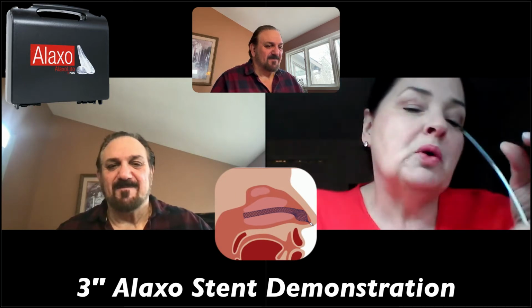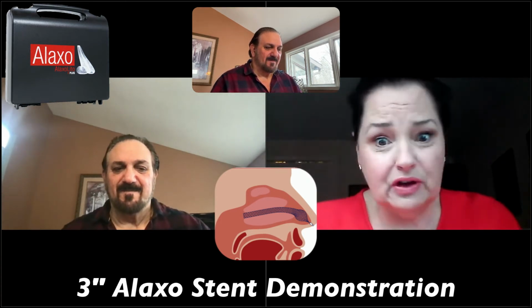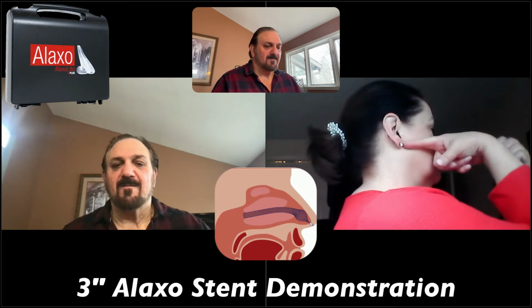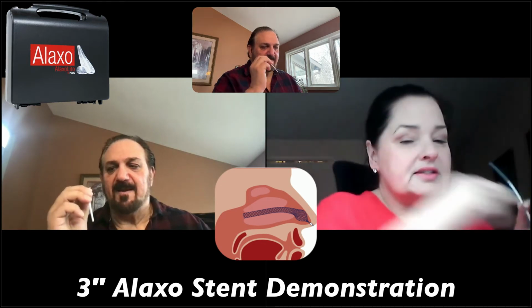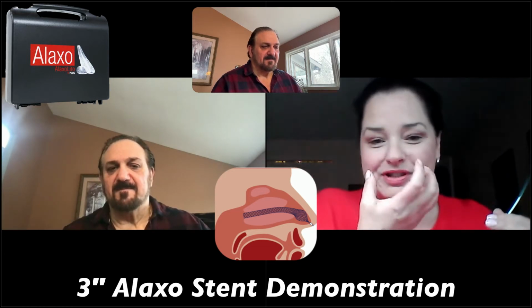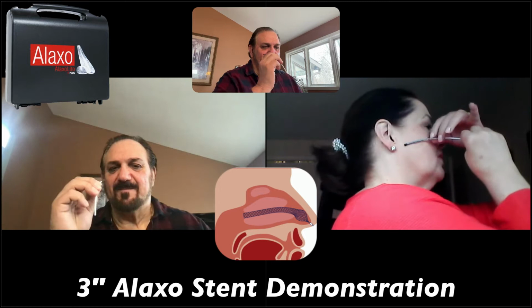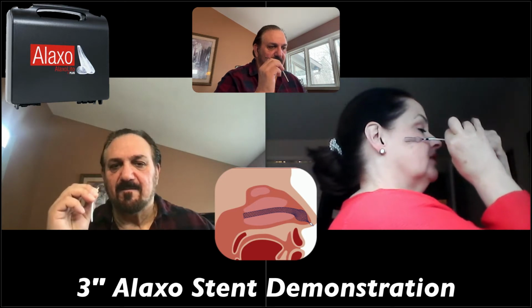So for me, and everybody's different, some people put these in and they're good to go. But for me, when you insert it, we're going to be trying to aim towards the bottom of your earlobe, going at a slight angle downward. A lot of people have this idea initially that they're going to put it up, because this is their nose, but it's not, and sometimes people run into trouble with that. So you insert it this way, as far as the insertion tube lets you, and then we retract this back to let the stent expand.